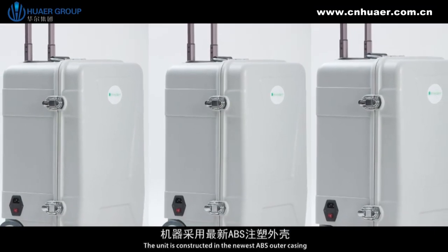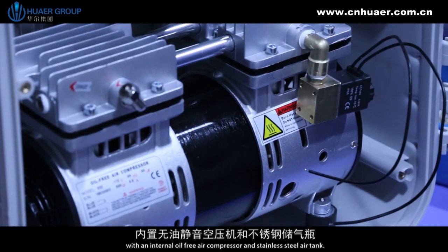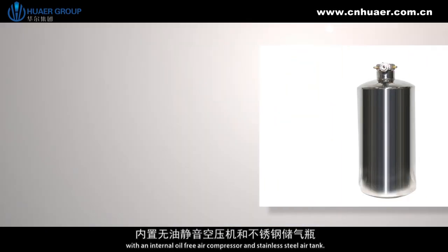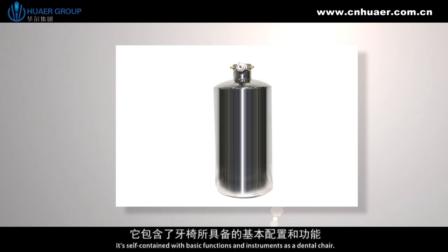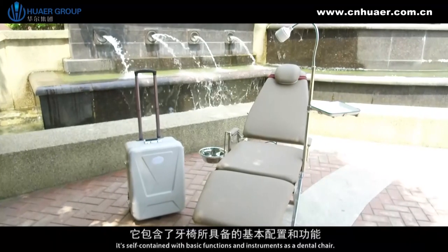The unit is constructed with the newest ABS outer casing, an internal oil-free air compressor and stainless steel air tank. It is self-contained with basic functions and instruments as a dental chair.